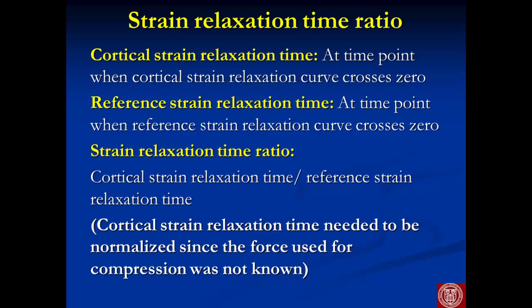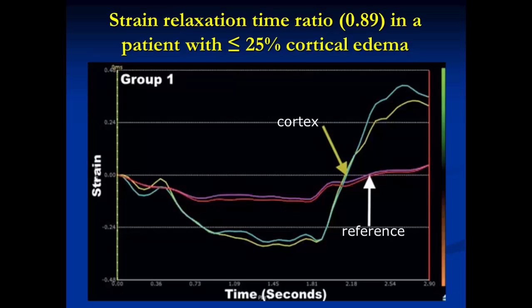As you know, for clinical usefulness, because the force used for compression is not known, we need to perform strain normalization.